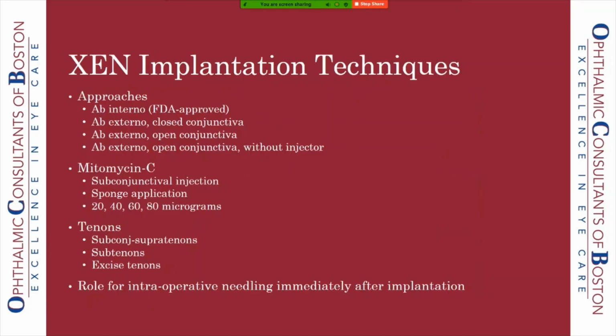So there are various implantation techniques. There's the ab interno technique, which, and I will show all of these. The ab interno technique is the only technique that's FDA approved. All the other techniques that are ab externo are considered off-label, but they're certainly in frequent use by many surgeons.